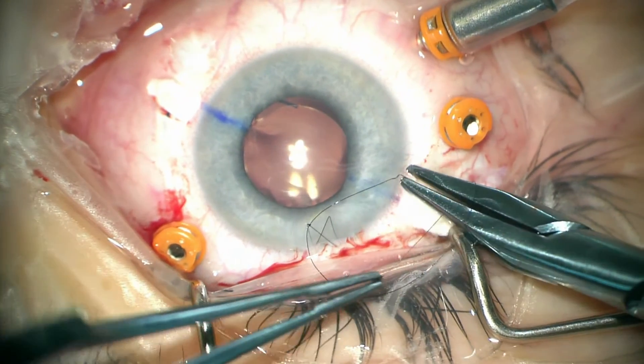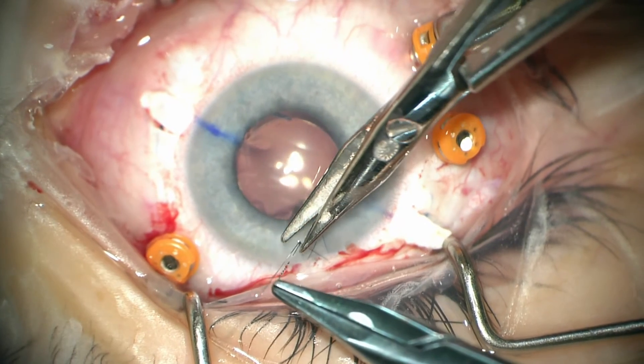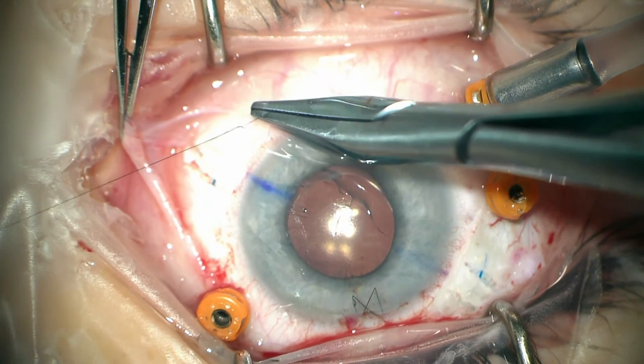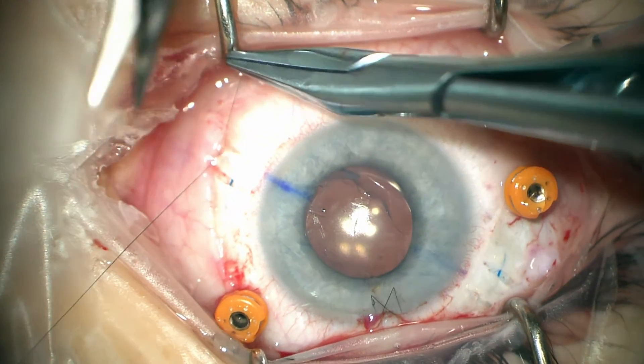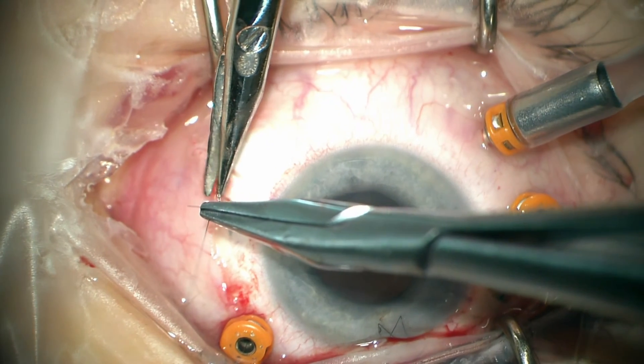I like to use suture to close the cornea as well as the scleral flaps. I just find that this is more secure and more cost effective than using glue. Once the flaps and cornea are closed, we take out the vitrectomy ports and close the conjunctiva with vicryl suture.